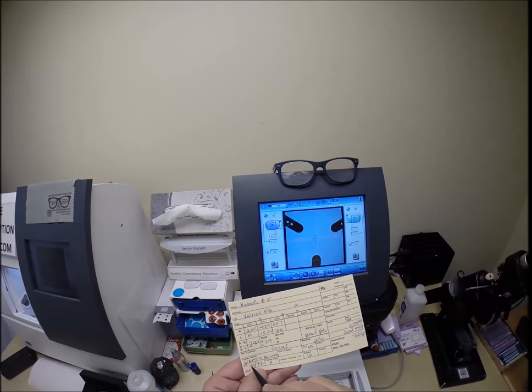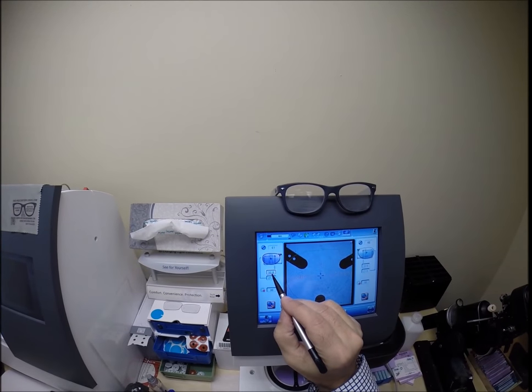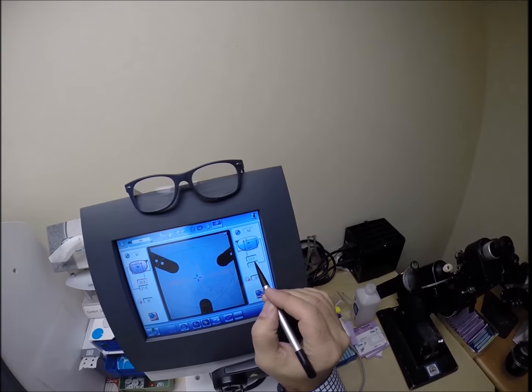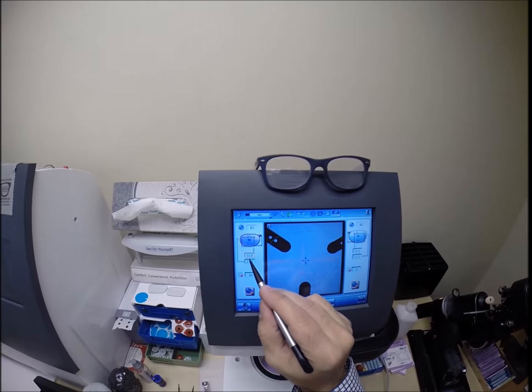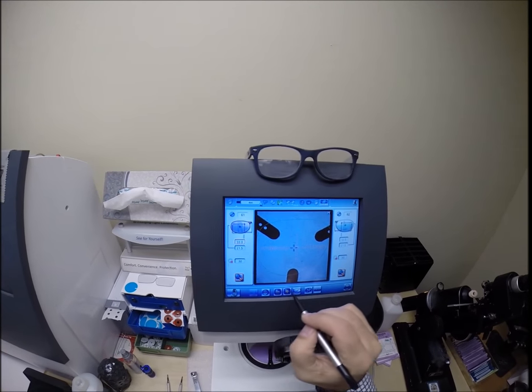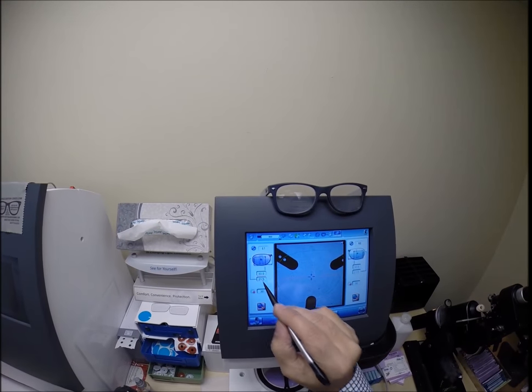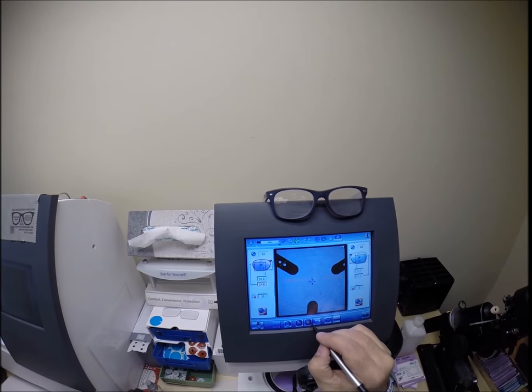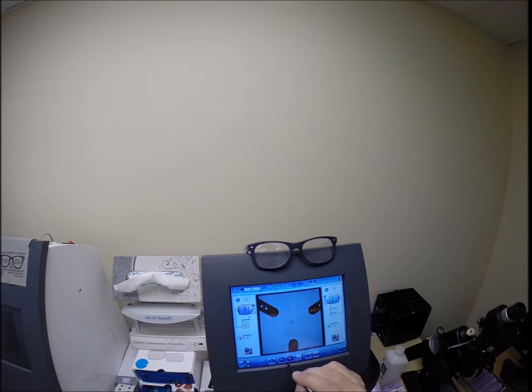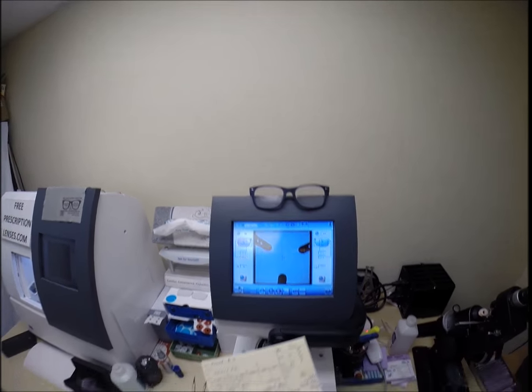Michael you know you need prescription because you got some crazy stigs, a little bit higher than average astigmatism. Your pupillary distance for your right eye is 33. It was at 32.5. I've raised it up by touching the plus button one time to 33. I'm going to raise the vertical OC height, the seg height, up to 29.